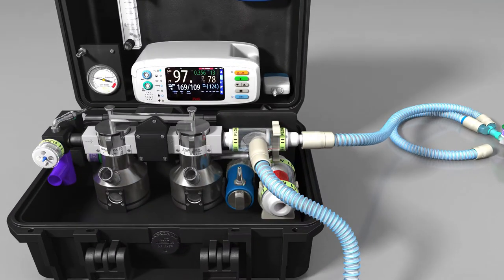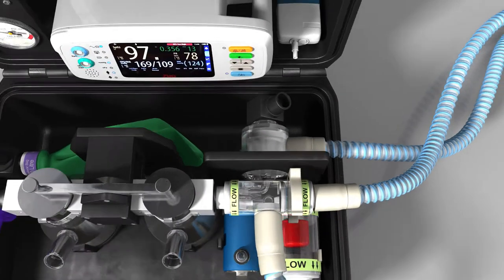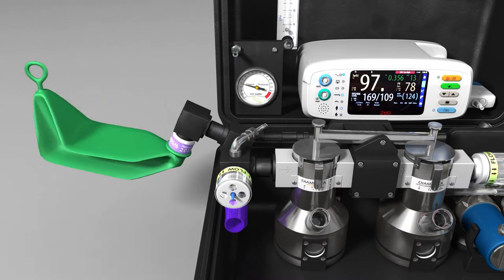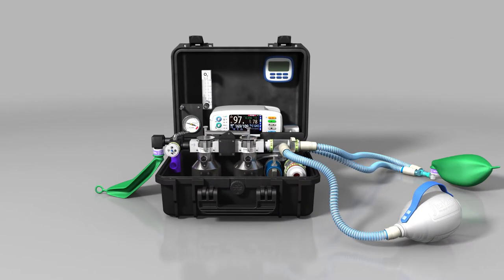Connect one limb of the patient circuit to the outlet of the inspiratory valve and connect the other limb to the expiratory valve. Rotate the reservoir bag located at the back of the reservoir block 270 degrees. Test the circuit is complete by using a test lung or 1 litre bag.